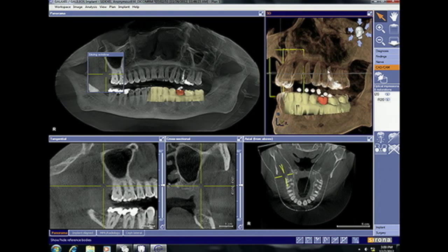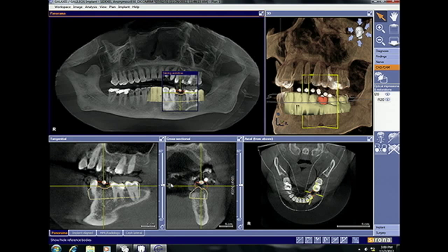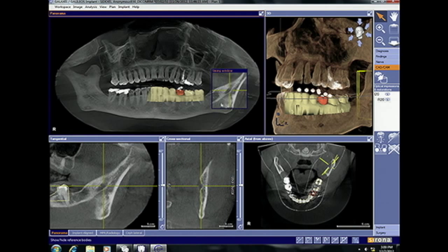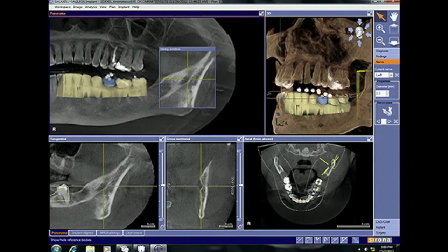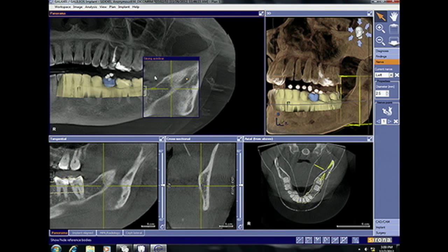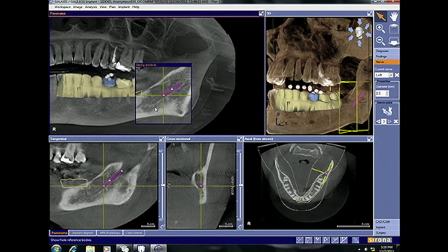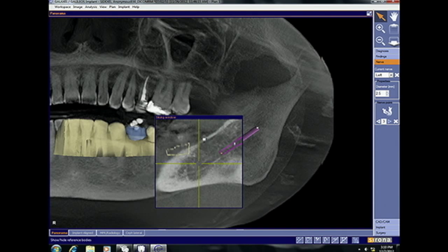Now that we have the restoration in the file, we can dial in and look at vital anatomy that we need to be aware of prior to considering an implant. I'm going to take the slicing window and map the nerve for the audience, just so you can see how easy it is. The first thing I do is move my slicing window over the posterior mandible where the nerve enters the mandible on the lingual border. I'll activate the nerve mapping tool using this icon underneath the nerve function, plot my first point within that canal space, then drag my slicing window along the border of the mandible, looking at the definition of the cortical bone that lines the canal space itself.